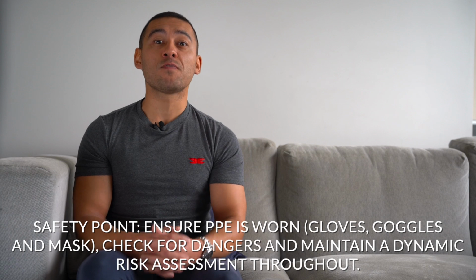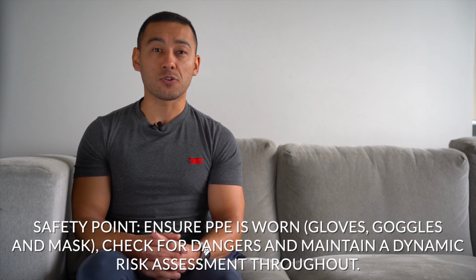It is contraindicated when there is suspected or known epiglottitis. Laryngoscopy technique can vary depending on the type of laryngoscope and blade selected. For this demonstration, I'll be performing direct laryngoscopy using a Macintosh blade.